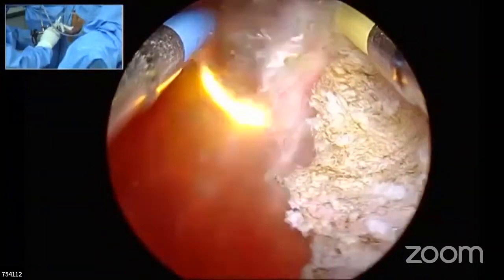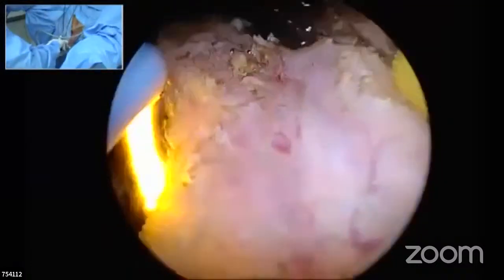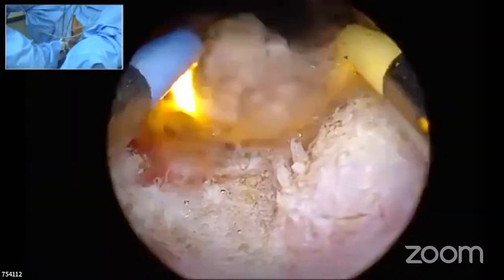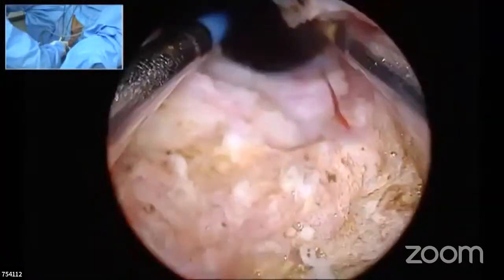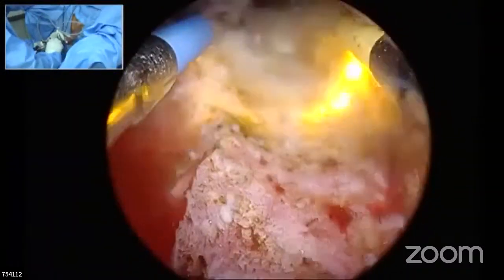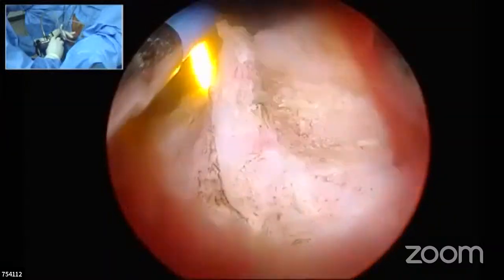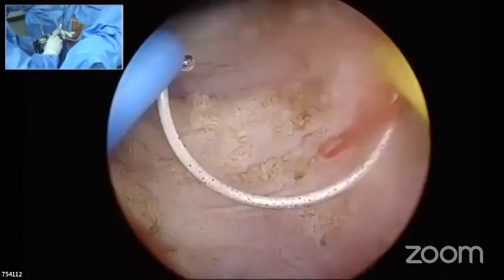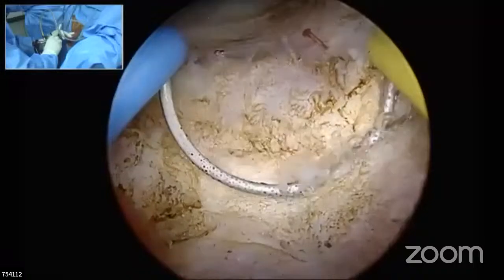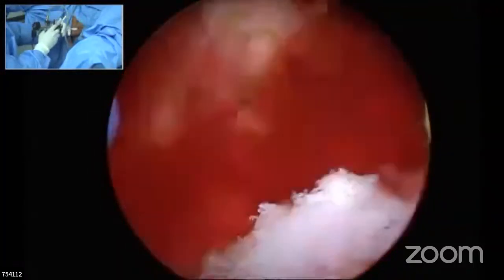What happens when people switch from monopolar to bipolar? What happens initially is they start losing the loops because they tend to cut with the loop, thinking that it is the loop which is cutting. No, they should not be doing that. So many times, even when we started bipolar, we used to lose a loop every case because we start cutting with the loop, because that's what happens in monopolar, that you start cutting with the active loop and there is a physical energy involved. So that needs to be avoided whenever you are doing it with a bipolar.